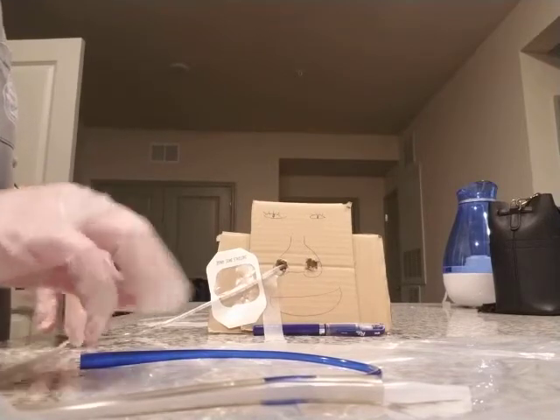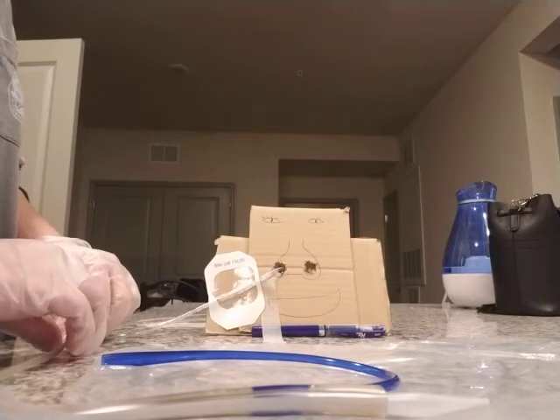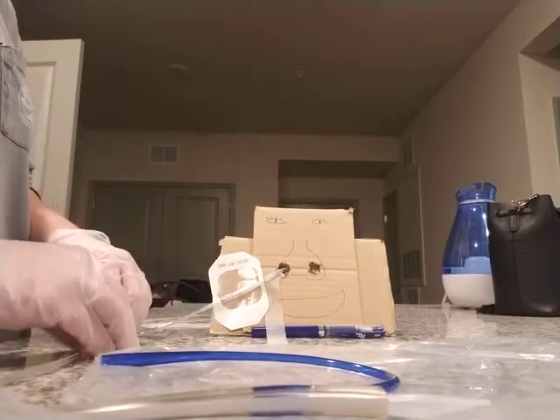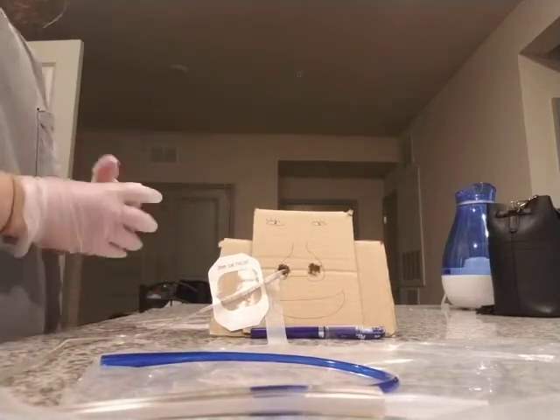And then I would fasten a rubber band to the end of the tube in a slip knot and pin the rubber band to the client's gown. So imagine, you know, down here, the client's gown, and making sure that there is still enough slack in the cord to have the patient move her head.